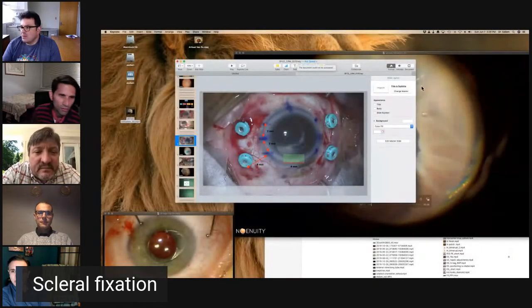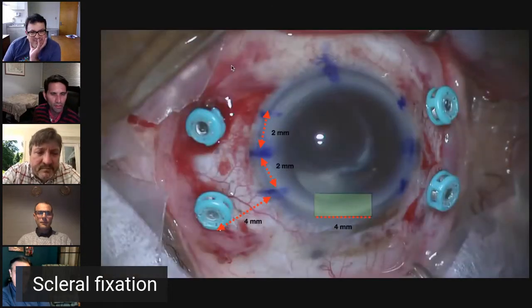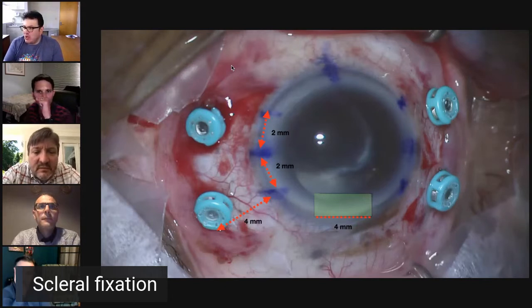Perfect. Thank you, Chris. That's great. It's a lot easier to manipulate than Prolene. Prolene is horrific. Yep. Very nice. So I'll continue with the Acrios IOL, and then we can have questions as we go.